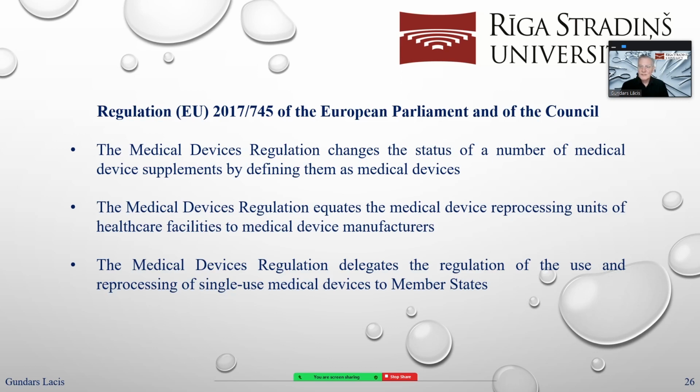The regulation equates the medical device reprocessing units in healthcare facilities to medical device manufacturers. It means that all those technicians, all those units now are manufacturers, not only just a part of the hospital, but manufacturers of medical devices.